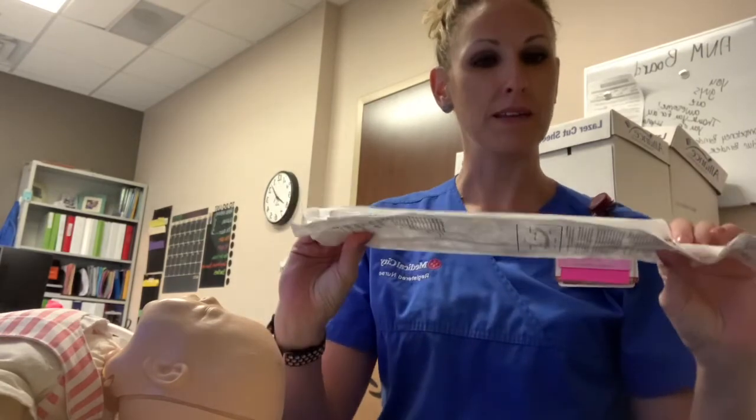This is the process for the application of a fetal scalp electrode on a fetal head. When we first enter the room and we decide that we're going to put a fetal scalp electrode on, we explain the procedure to the patient and we wash our hands. We're going to make sure that we have our supplies at the bedside and we have a pair of gloves. The supply is the fetal scalp electrode. It comes in a package.